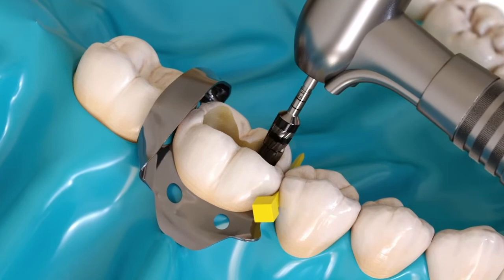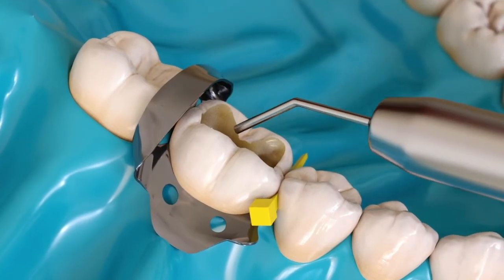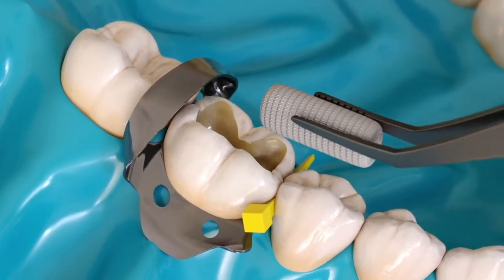Step 1: Prepare the cavity. Clean the preparation with pumice and water, then rinse thoroughly and dry.